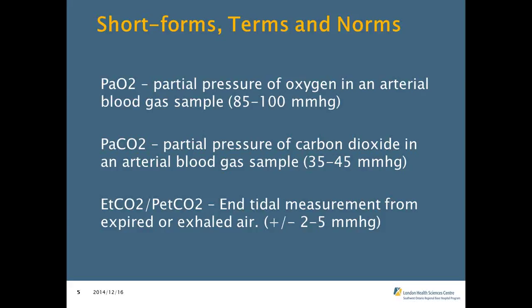And again, that's simply in a healthy individual. So someone who doesn't have a disease process going on, they correlate relatively well, but as soon as a disease process occurs, your EndTidal CO2 and your concentration of carbon dioxide within the blood isn't always precise, and that's where you tend to have to look at trends over time.